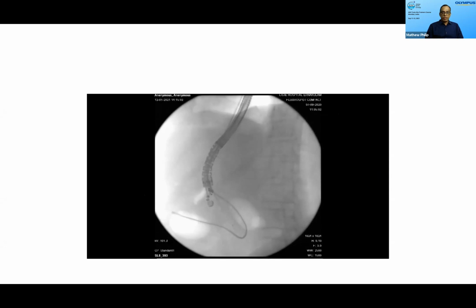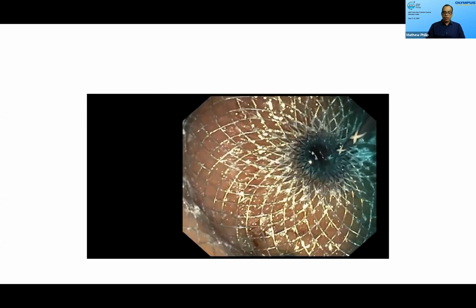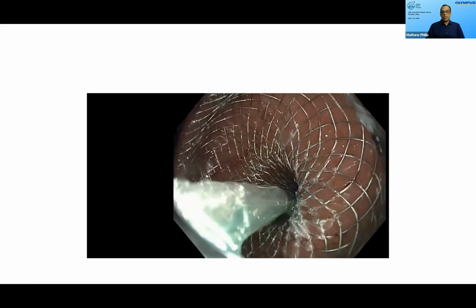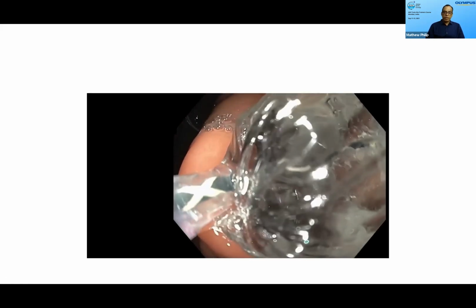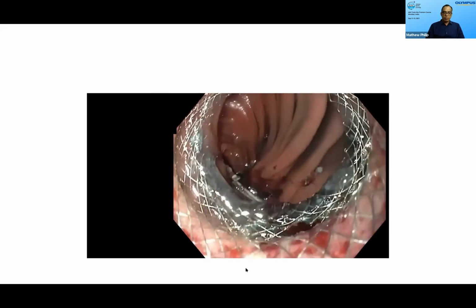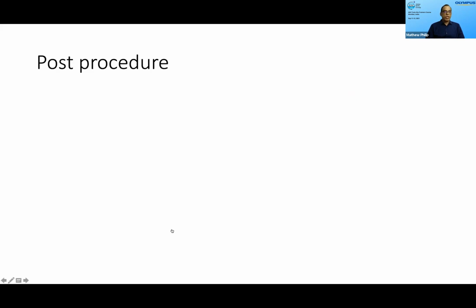Make sure that you are using fluoroscopy also to make sure that it is delivered properly. You start seeing the methylene blue coming out. That means your delivery system is correct. And once you have delivered it, you can take out the EUS scope and use an upper GI endoscope to pass a balloon. This is not done by many people, but some people do it. But I think it is okay to do that, so that you can visualize the opening very well.